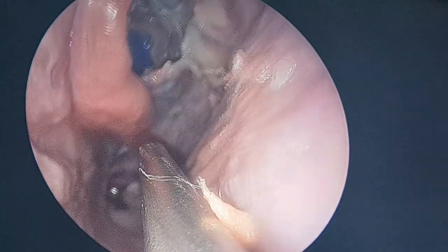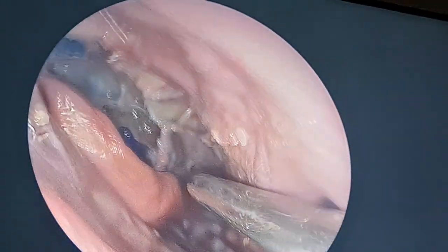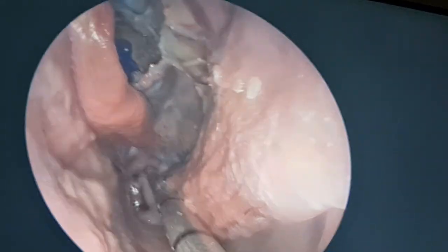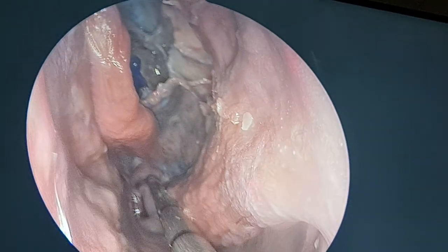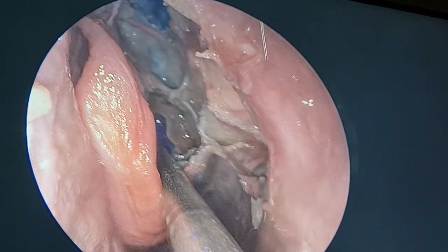Can somebody, Satish, yes sir, can you hold this suction here? Yeah, hold the suction and keep irrigating with this in between my telescope. Straight. Okay, take this. See, this is putting up the floor. See, like this. Just keep on sucking up.